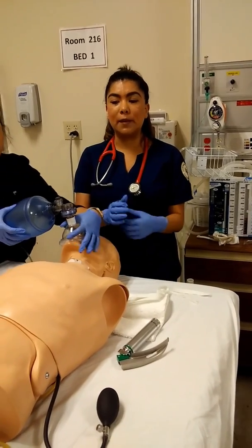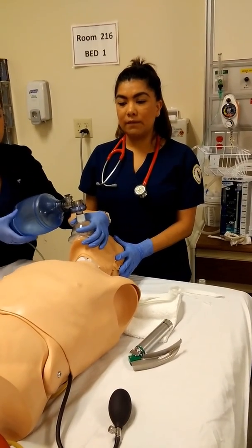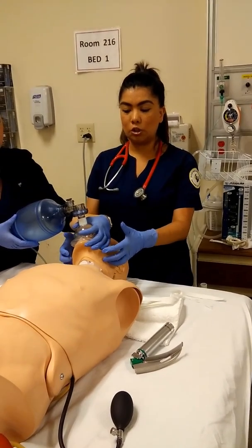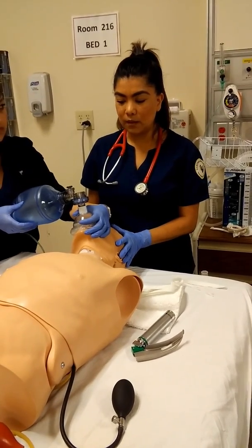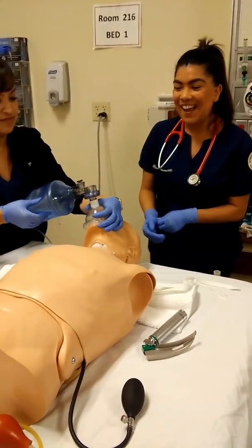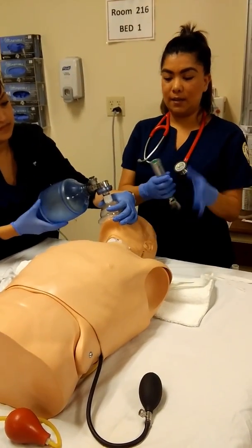You want to position the patient. If you want to properly position the patient, if they have a cervical injury, then you would do a jaw thrust. Other than that, you would just go ahead and place them in a sniff position. So this is Ruby. She's going to now be helping me. She's my assistant. And I'm going to go ahead and perform.